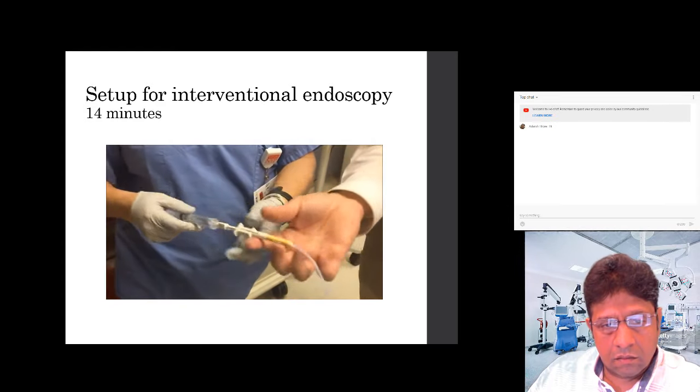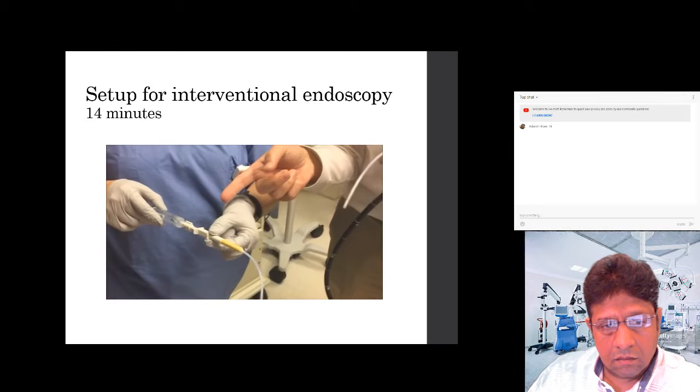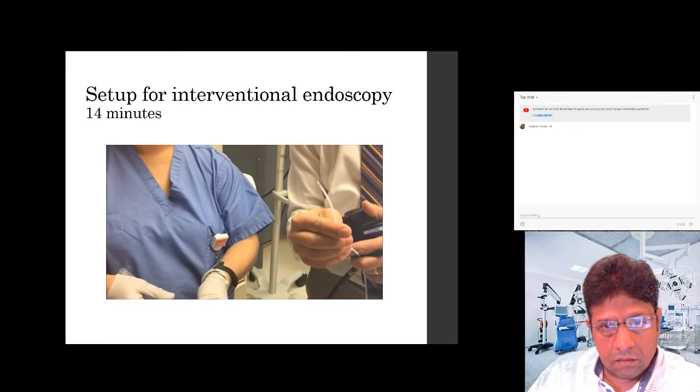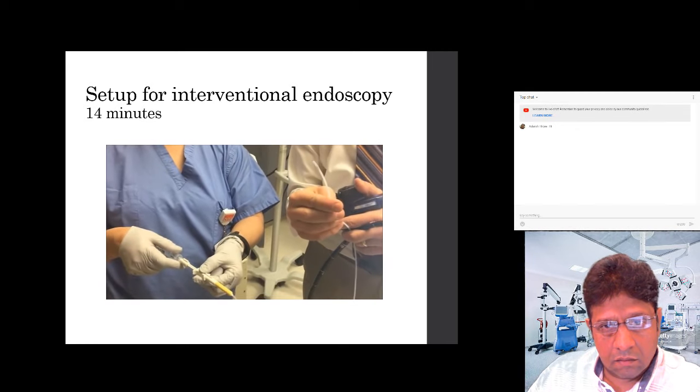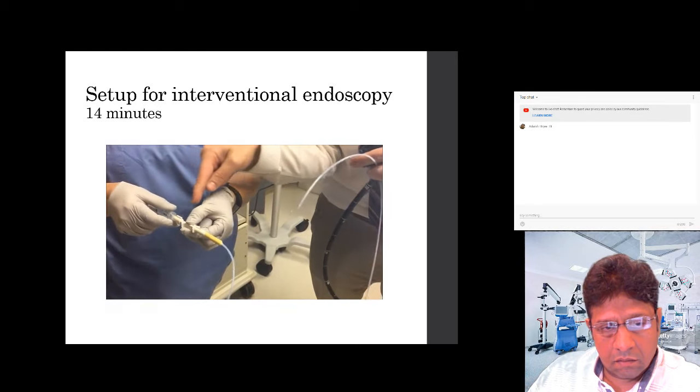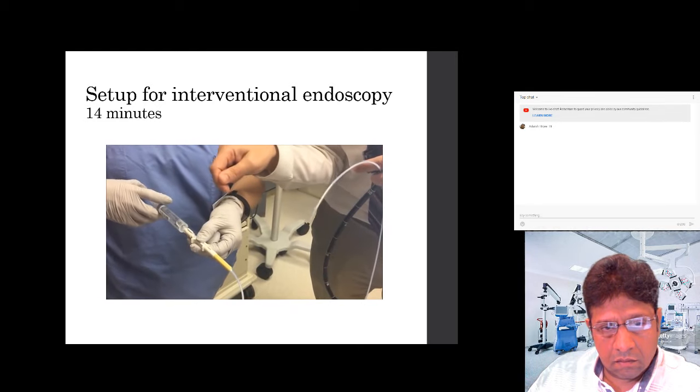Right, and then if you look, by grabbing it down here, if you push it in and out, see, we're just pushing it in, and you can see the needle coming out, right? And then to pull back, you just pull the needle back out. You can see the mechanism here. You slide the syringe in, slide it out, and that's how you bring the needle in and out.